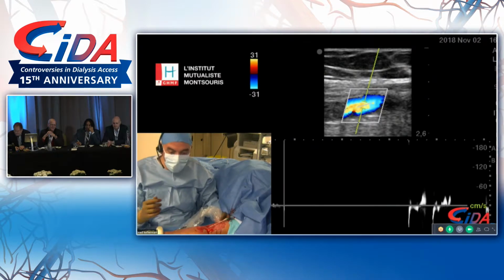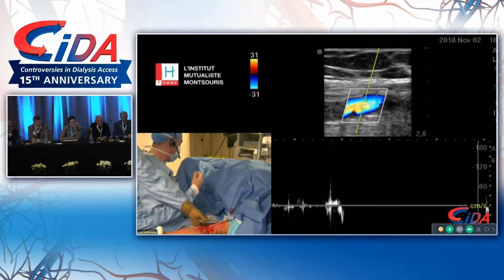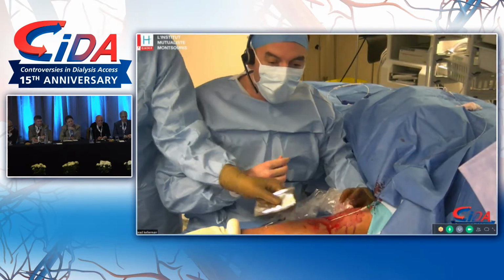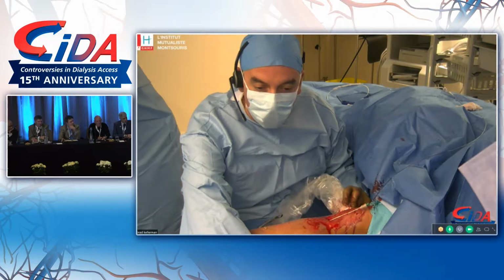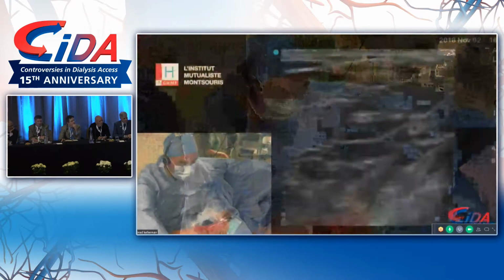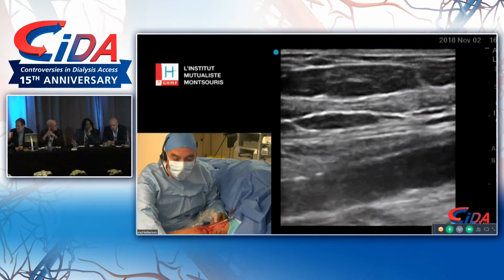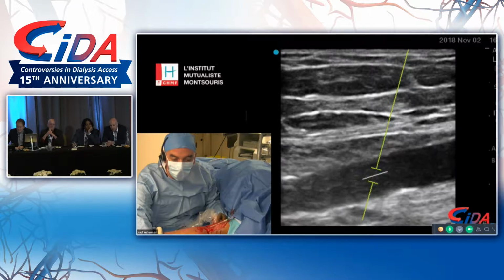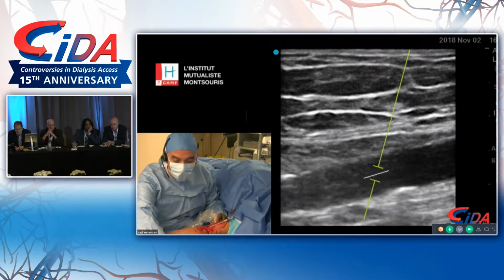So, Alex, we have about a minute or two left before we switch on to other things. Perfect. So I'm just going to measure the flow for you while you ask me a question. Any questions from the panel? Rob Jones from Birmingham, UK. Hi, Rob. How are you? Well done. Great case. Thank you, sir. Is the patient under sedation and IV analgesia, or are they completely awake with local anesthetic?